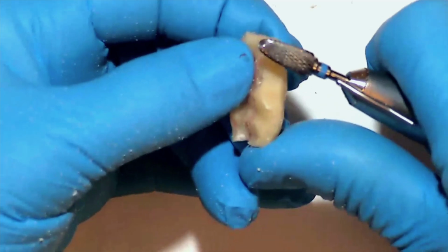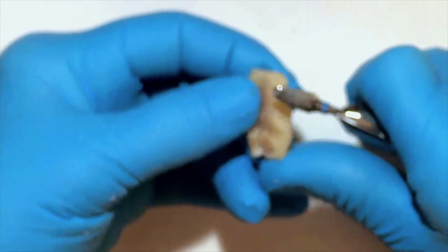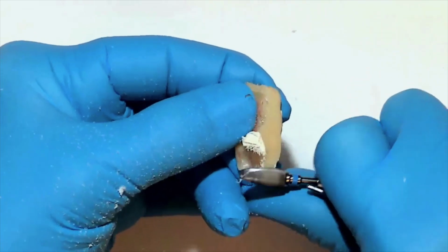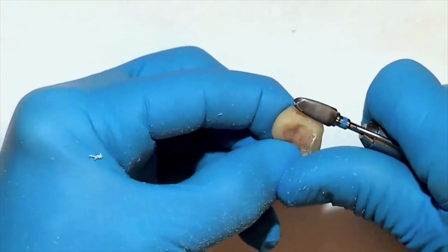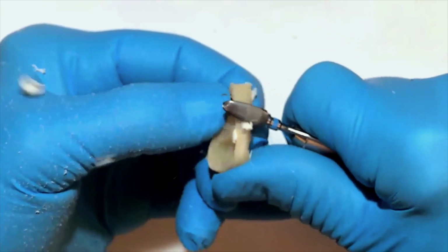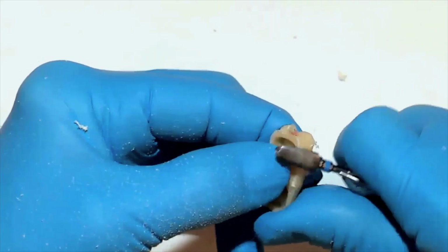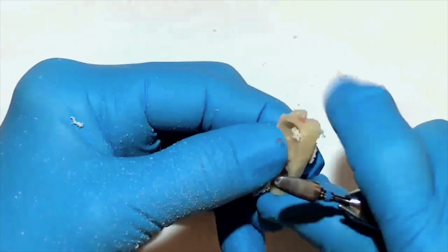We're going to continue carving our proximals and also our buccal and lingual surfaces. Again, keeping in mind that the occlusal markings we made have to be paid attention to. On the palatal side, the marking we placed on the palatal occlusal line angle and approximately 1 millimeter beyond that to the gingiva, toward the gingival. We will try and maintain that and not violate that. We're just going to continue carving here, and we'll jump ahead a little bit so as not to bore you too much.